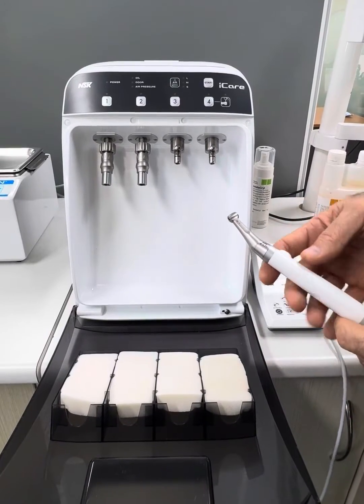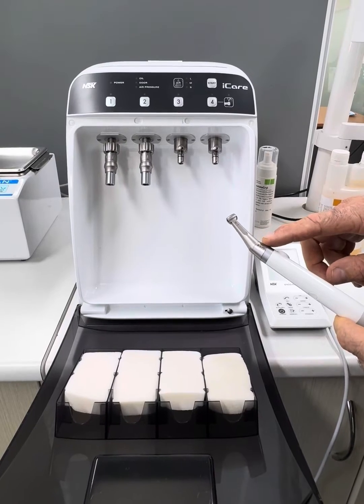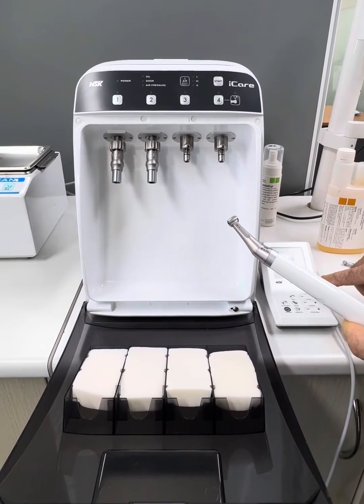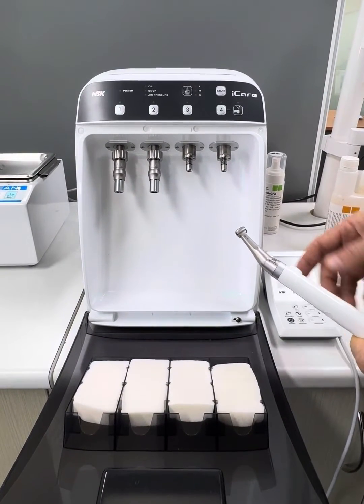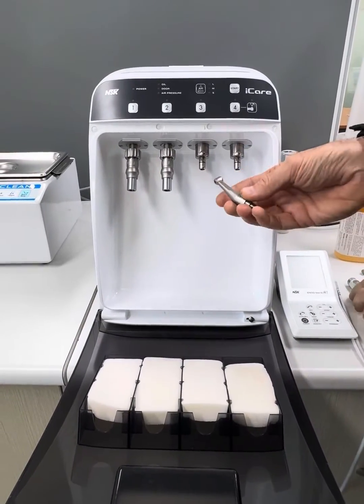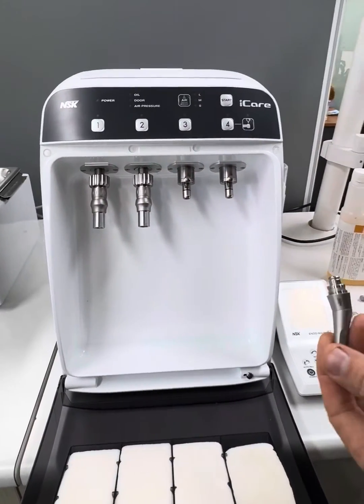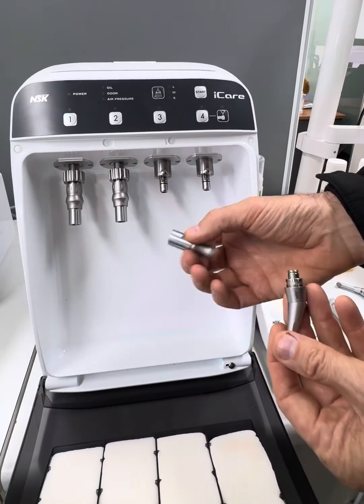Hi, it's Steve here from Leading Dental. I just want to quickly go through the adapter that's available to lubricate the heads for the Endo AT and the Endo TC2. Basically, if we need to lubricate these and put them into our eye care, they're not going to fit onto any of the standard fittings. So what you can do is buy this little adapter.